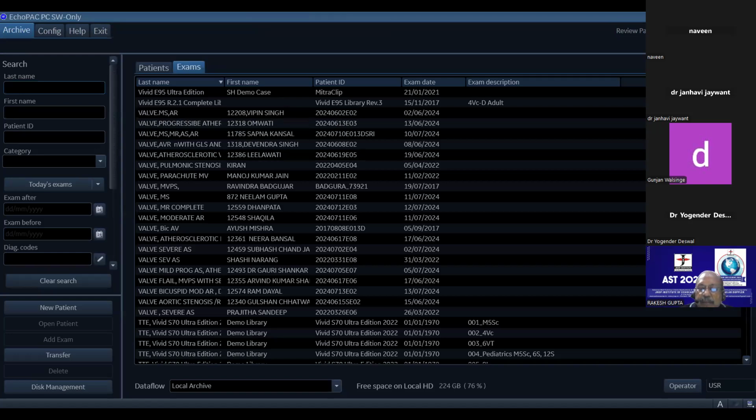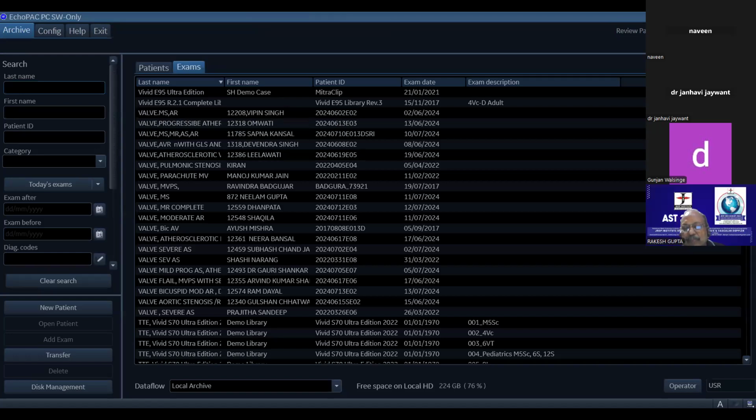And when to comment sclerosed, degenerative, or calcified? Thickening without any hockey-stick shape will be sclerosed, degenerative. Degenerative will come at the age of 55, 60 years. In rheumatic it will come much earlier. Sir, in aortic valve, sir. Am I not talking of the aortic valve only? Okay.